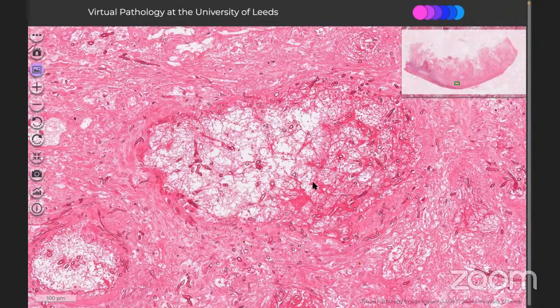Number two, after that, you should confirm the fungal lineage. You can do a PAS and a GMS just to highlight that it is a fungal organism, and you can refer to molecular microbiology for PCR diagnosis of the species. So mucor is actually an opportunistic or infective organism which occurs in many settings.